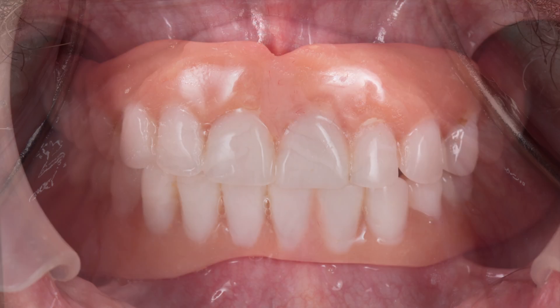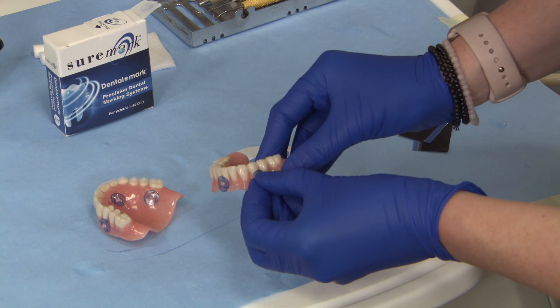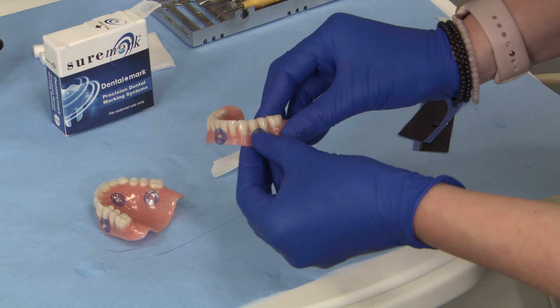This case began with verifying the fit and aesthetics of the patient's existing denture. It was important that the denture utilized for implant planning has a well-fitting base and that the teeth were in a relatively acceptable position. The initial records for implant planning followed the dual scan protocol.